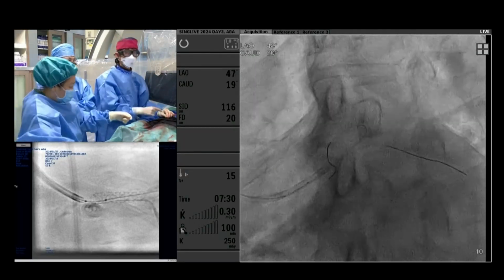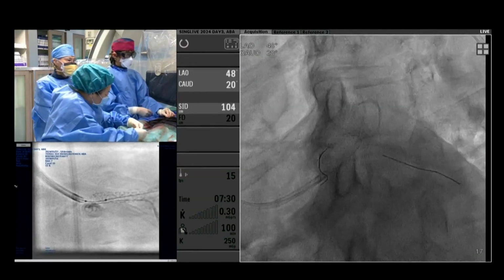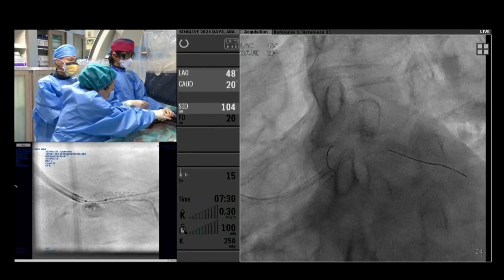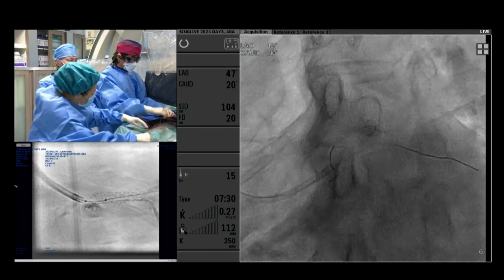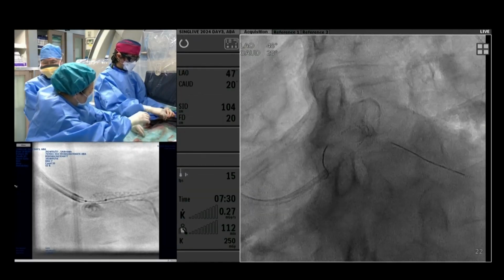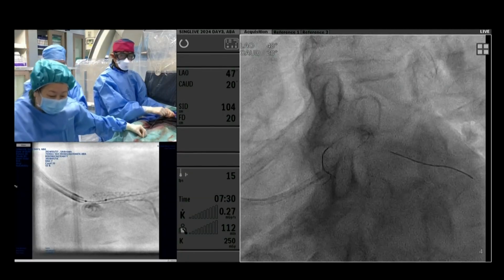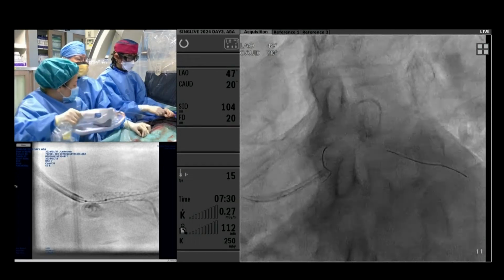I think the microcatheter shows whether the distal vessel is still patent. At the end of the day, if you don't have edge issues and the EKG is unchanged, then I think there's no doubt. And most of the time, tip injection in a big vessel, the quality will not be good. Unlike a channel injection, with tip injection you just need to repeat it, puff a few cc, and you don't get a good image. So it didn't give you much information at the end.